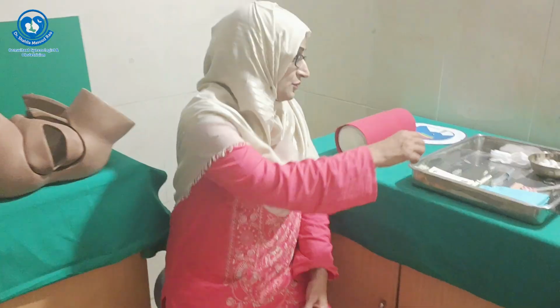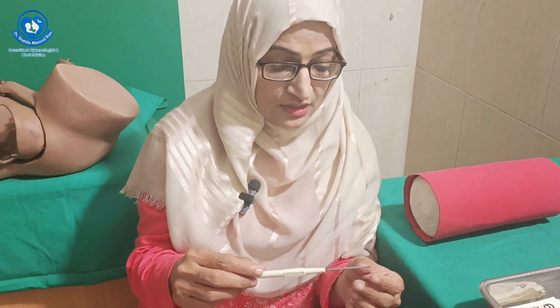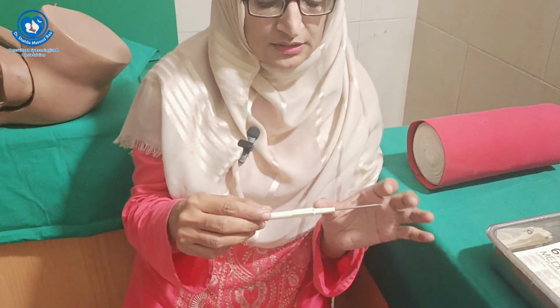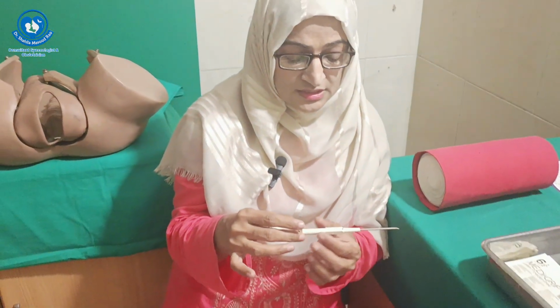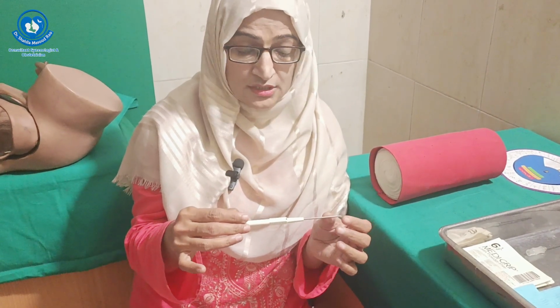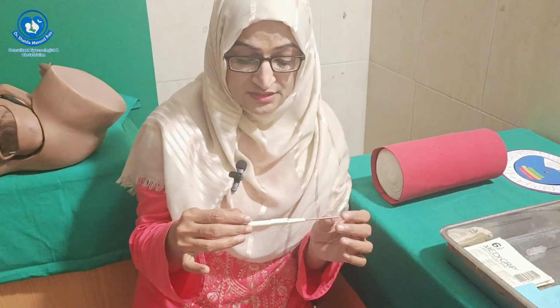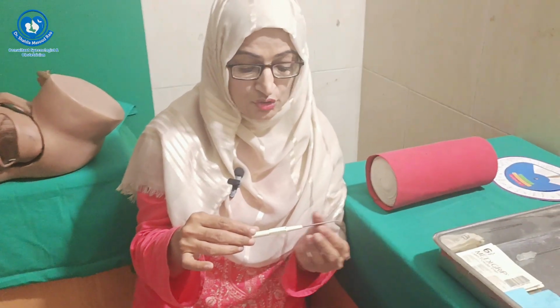So there are different parts of the Implanon. I'm going to demonstrate the parts of the Implanon. You can see this is the Implanon that has etonogestrel. This is the used one. So this is the specific Implanon inserter, or specific Implanon applicator. This is the seal. This is the obturator groove at the tip. This is the obturator support, and there is a shield over the needle.